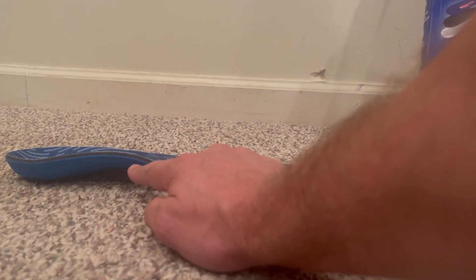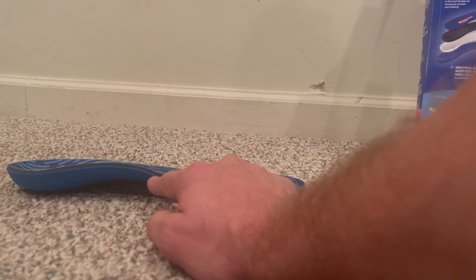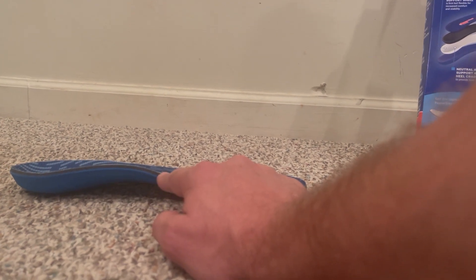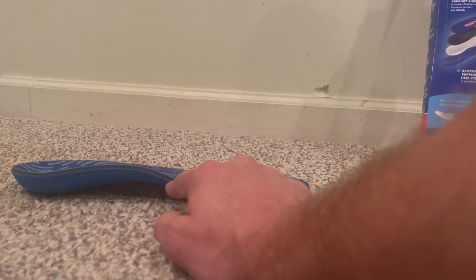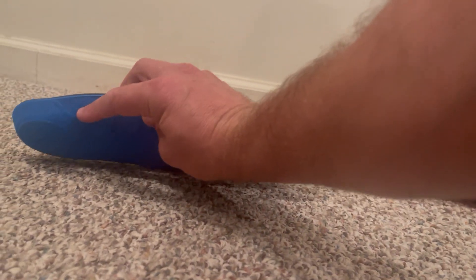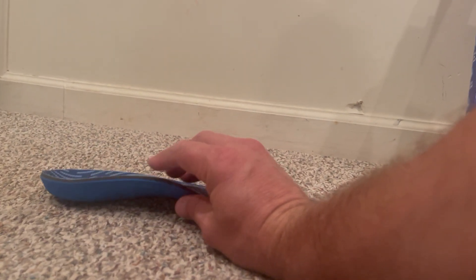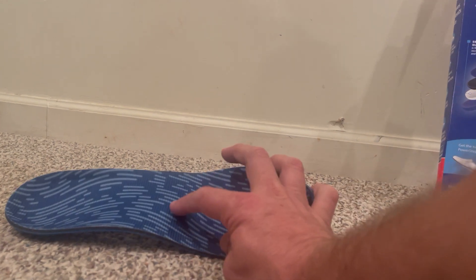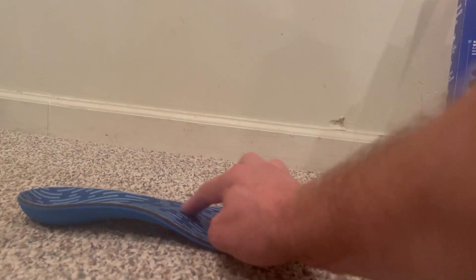There are three different layers. The bottom layer is more of a foam base that helps with cushioning. Then there's this black layer, which is the cushion part as well. And then there's a part you can't see underneath — it's a neutral arch support and heel cradle that provides heel stability.